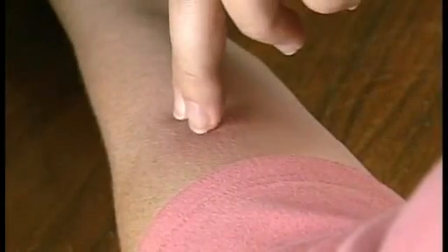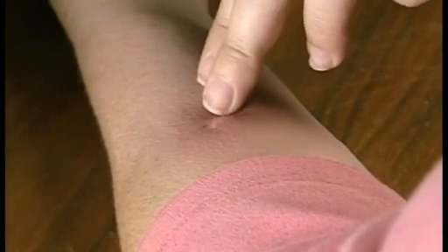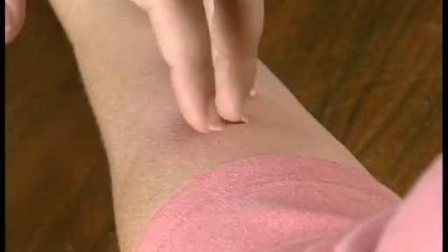If the margin is not equally clear all the way around the induration, palpate around the induration from the easily felt margin to the not so easily felt margin.